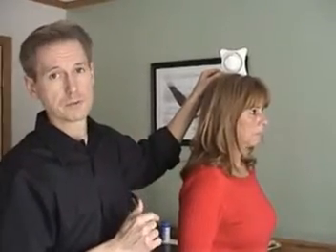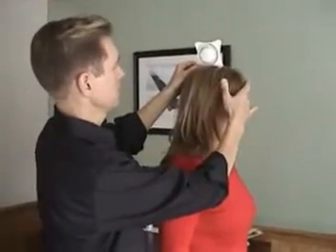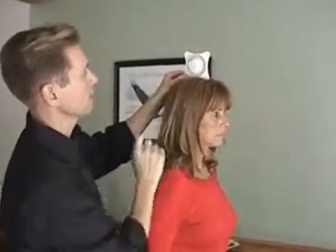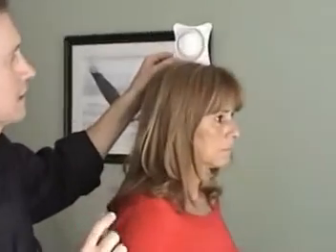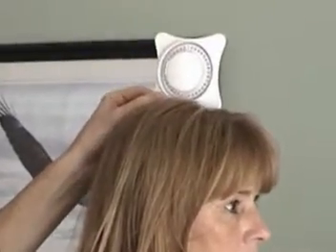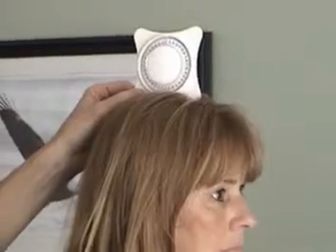We're going to start first with flexion extension. You want this person standing in a neutral position. It's very important that the inclinometer be centered at zero. When you set it down, it's important to just let it zero itself.